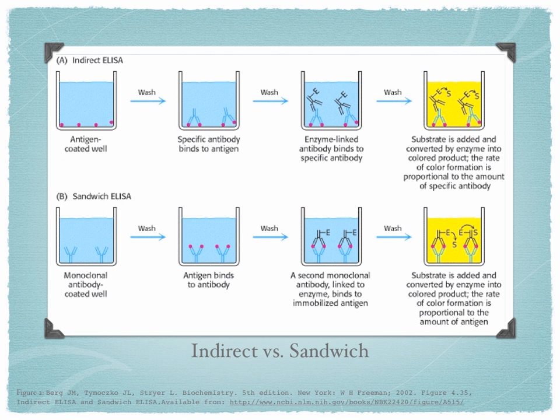It is then washed again, and a secondary antibody that carries an enzyme is added. Thus, the name of the technique, which is Enzyme-Linked Immunosorbent Assay. It is washed, and a substrate is added. The substrate plus the presence of an enzyme will change the color and detect the presence of an antibody.